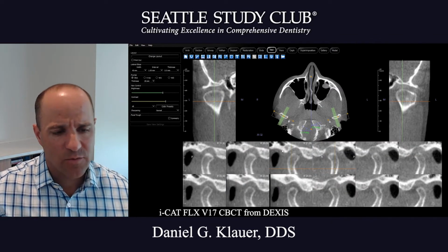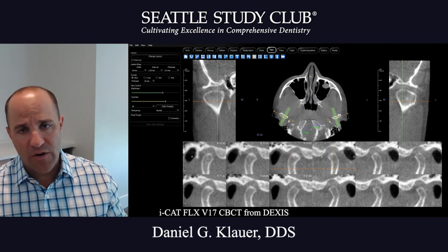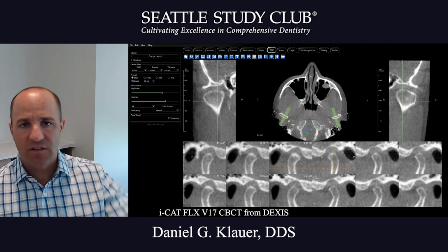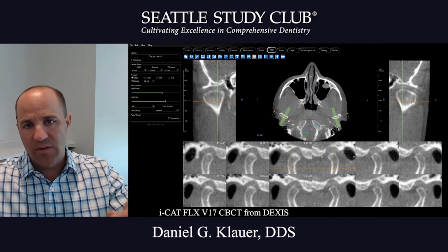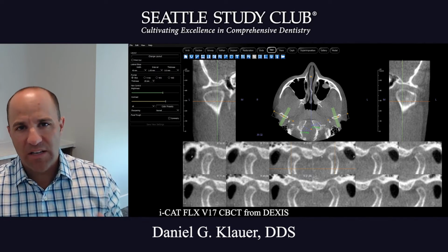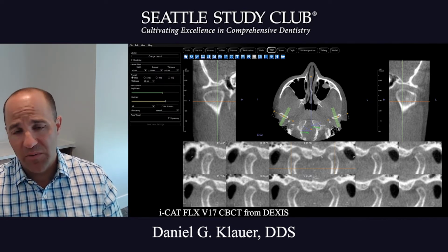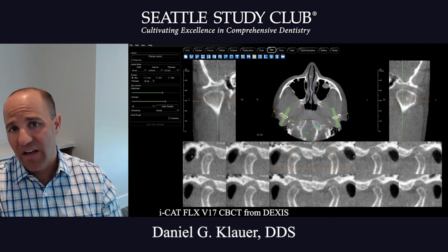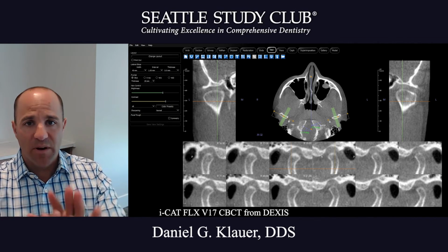So the way I got comfortable reading these is I would go through multiple of them over and over and over, but I'd send them to a radiologist. So then you take your radiology report, see what they found, and take your report, see what you found, and then compare. But I'd say it's best practice to look at it yourself first and have a system by which you go through. And you can just take the template that the radiologist uses by body part and make sure you touch everything. And then you compare those two notes.